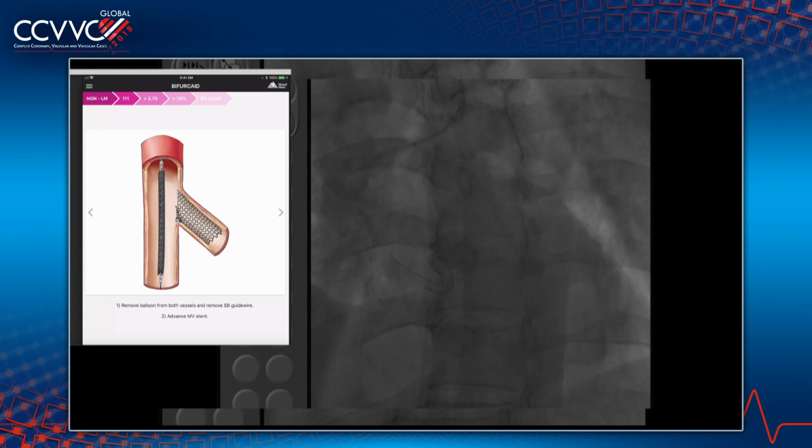What we'll do is rewire and put a stent in the LAD. Unlikely, because it is too big. Then you need to go for lunch, but we'll continue on the side. While you are tying the wire, that is a 35 wire. Is it? Yeah, I got it.